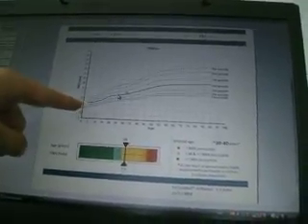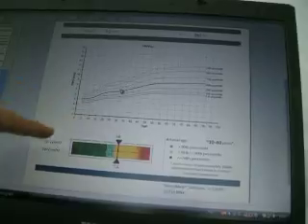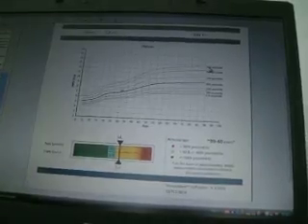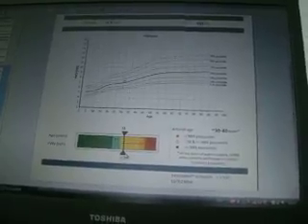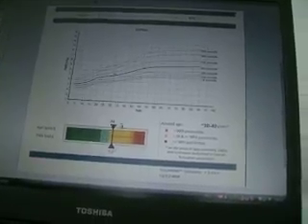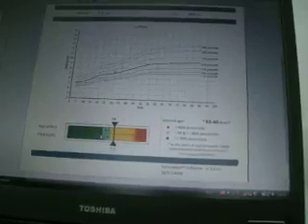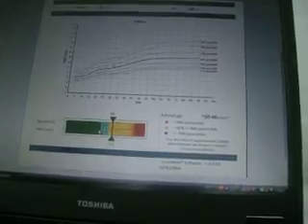So, just as a quick reminder, the thick blue line is the average at all ages or age groups, and the different lines refer to different percentiles of that specific age group. And we give finally an estimation of the patient's arterial age, which is a very trendy phrase right now. So we would say that her arteries are 34 years old, which is quite in a good accordance with her real age.